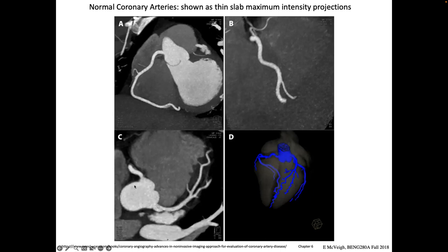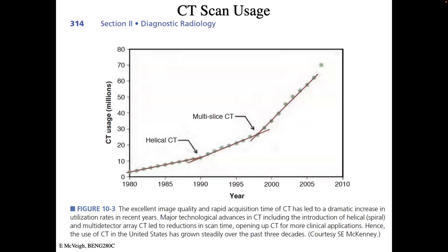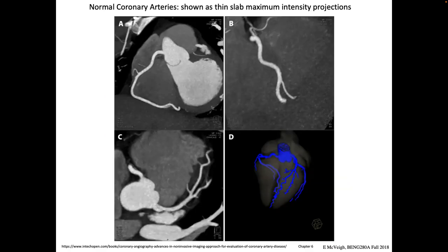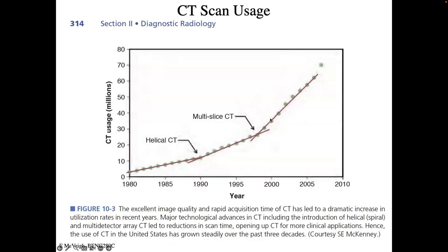The LAD comes down with gorgeous branches clearly resolved in these projection views — it almost looks fake, it's so unnaturally good compared to other imaging modalities. Those are normal vessels; we'll look at abnormal vessels shortly.